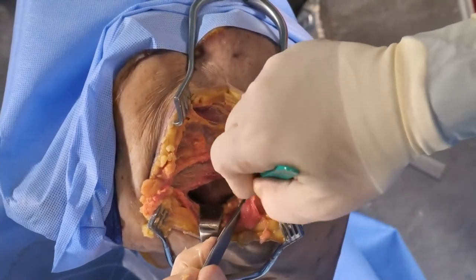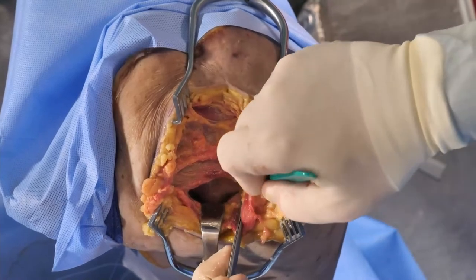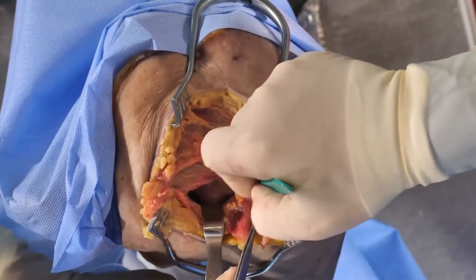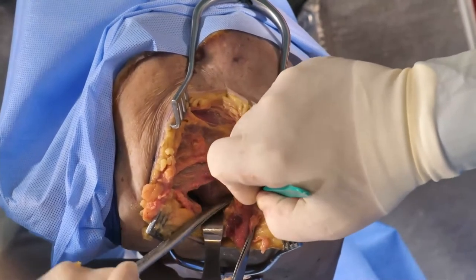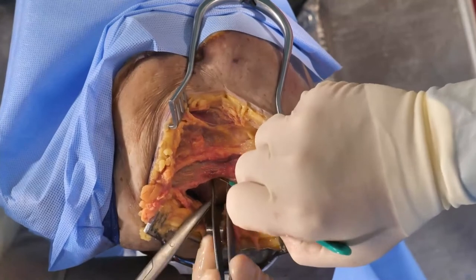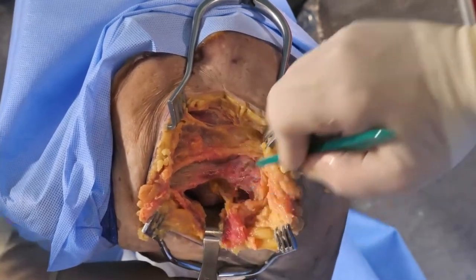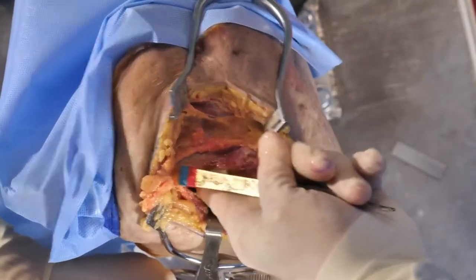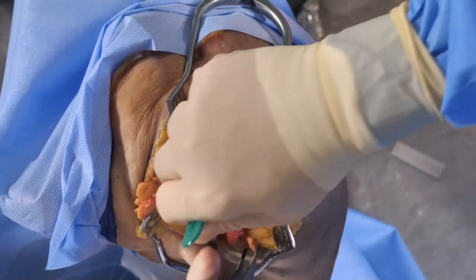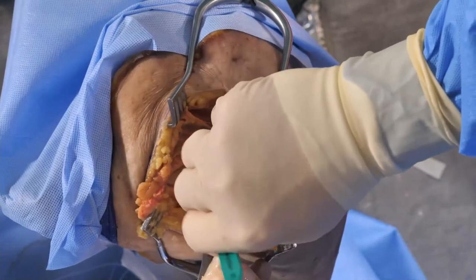Let's try to get a little bit more of this AC ligament. This patient is older, so not as robust as we would like to see, but you can get a sense as we come off here what we have going. Now let's try to go in here and see if we can find those ligaments. You can see the posterior conoid is behind here and then our trapezoid comes up laterally here.